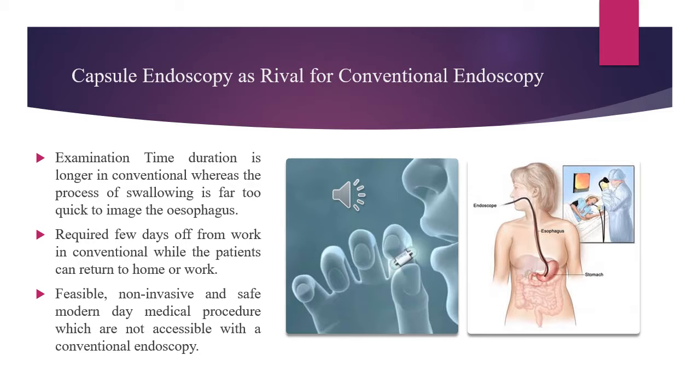It is often required to take a few days off from work for the entire procedure of conventional endoscopy, and riding vehicles is forbidden for the rest of the day, while in capsule endoscopy, after ingesting the capsule and having the data recorder, the patients can return to home or work. Capsule endoscopy is also a feasible, non-invasive, and safe modern day medical procedure which is not accessible with conventional endoscopy.